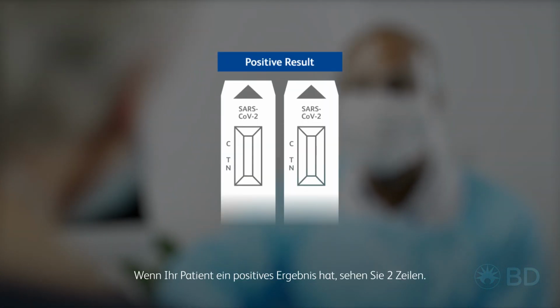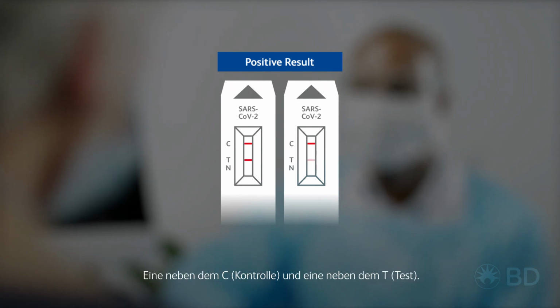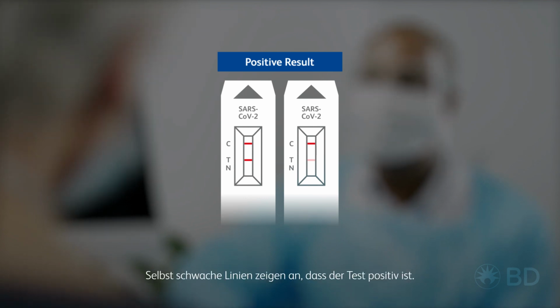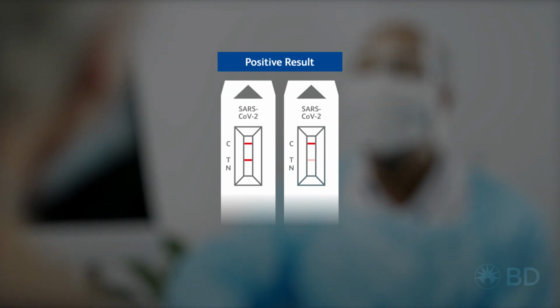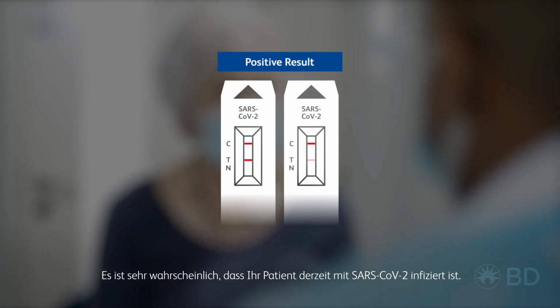If your patient has a positive result, you will see 2 lines. One next to C, control, and one next to T, test. Even faint lines show the test is positive. It is very likely that your patient is currently infected with SARS-CoV-2.